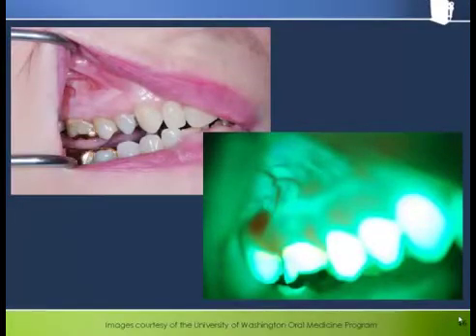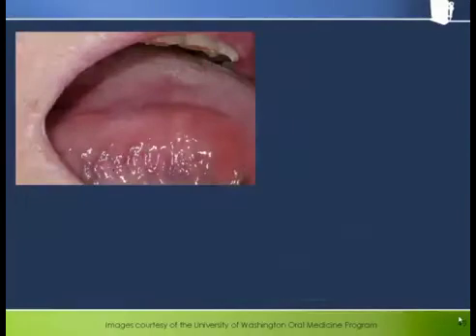Another example of an ominous looking area in gingival tissues. Note the dramatic appearance through the VELscope and the large blood vessel that seems to be feeding the abnormality. This lesion was found to be dysplastic upon biopsy. Note also here that the leukoplakic area anterior to the lesion does not seem to show a loss of fluorescence.